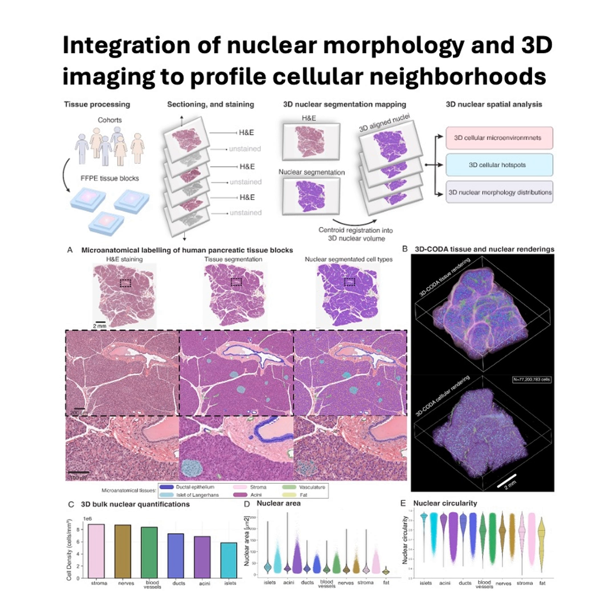So for so long, those classic pink and purple 2D H&E slides have been the gold standard, right? The benchmark. They have been, yes. But what's the real rub here? What's the catch with relying only on those traditional methods? What are we missing? The fundamental flaw, really, is that 2D images, just by being flat, lose critical spatial information. Imagine trying to understand a really complex sculpture, but all you have are 100 incredibly thin slices of it laid out flat on a table.